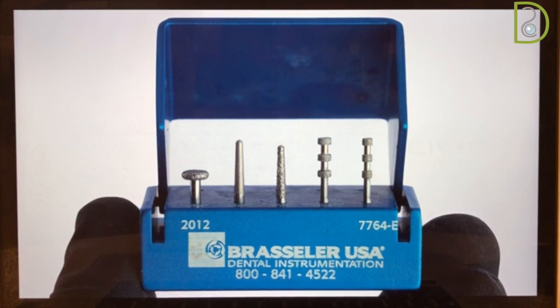No mock-up, nothing. Well, to start a freehand preparation without a mock-up, a few studies actually found that in the case of freehand preparation, the proximal and cervical enamel was reduced by more than 0.5 millimeter in the vast majority of cases, with exposure of dentin in most teeth.